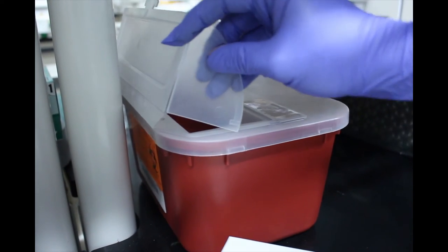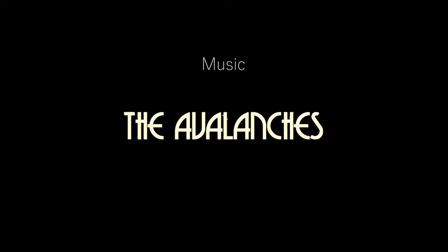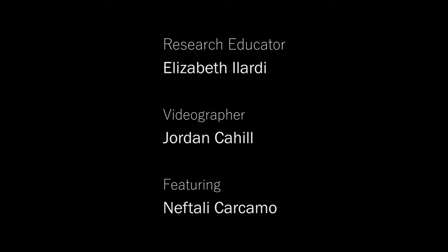Disposable needles and syringes are usually discarded in the sharps container. Non-disposable needles are washed appropriately, dried, and placed back in the oven promptly. The syringe is rinsed and discarded in the trash.